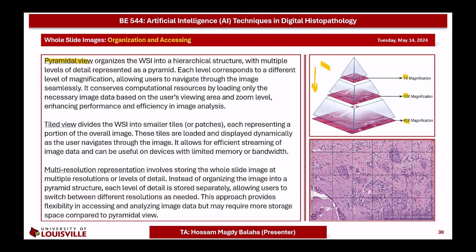So this organization will conserve computational resources by loading only the necessary image data based on the user's viewing area and zoom level. This will enhance the performance and efficiency in image analysis.